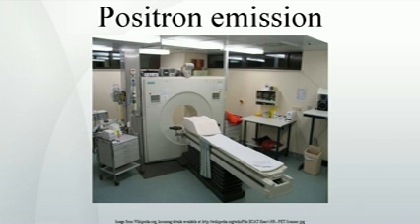Combination of PET with CT or MRI. PET scans are increasingly read alongside CT or magnetic resonance imaging, MRI, scans, with a combination, called co-registration, giving both anatomic and metabolic information, that is, what the structure is, and what it is doing biochemically.